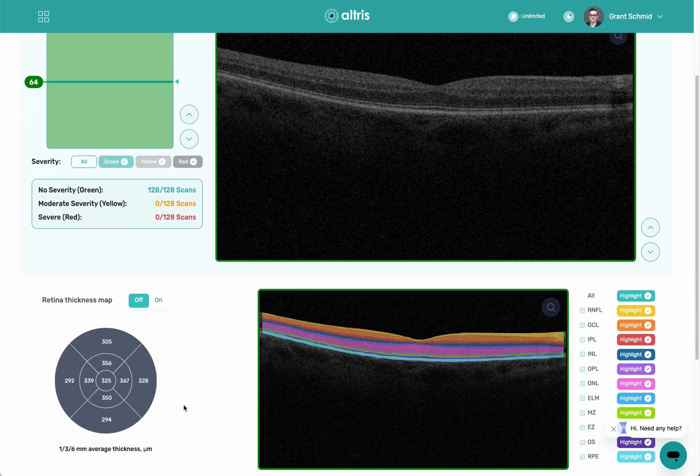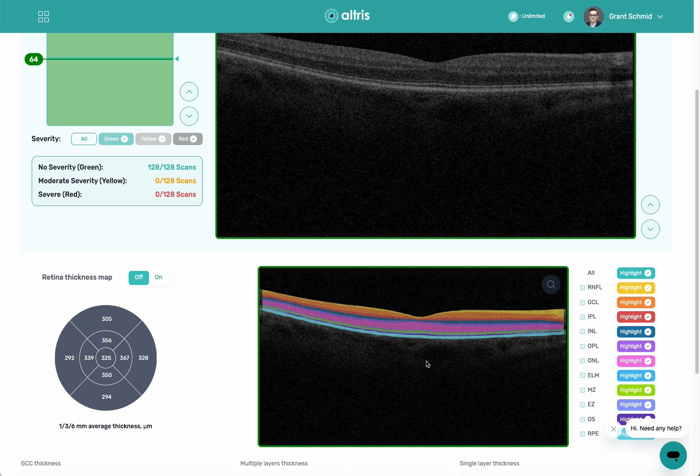As I scroll down, you'll also be able to see that we have the ability to do our own segmentation, for a bunch of different reasons. If you think about the OCT manufacturers that are out there right now, most of them use a normative database that includes about 350 patients. Those patients are segmented by age, gender, and ethnicity. So when a patient comes in and has an OCT done, they're looking at maybe two or three people out of that 350 that match that patient's gender, age, and ethnicity, and compare them to that database to see if they're normal or not.